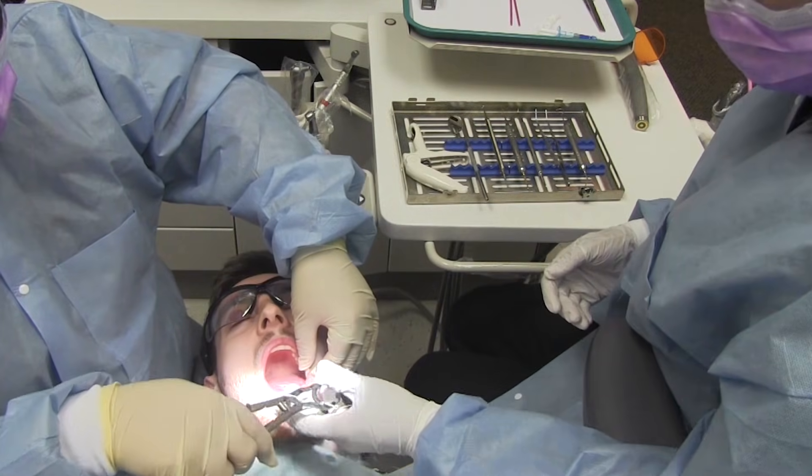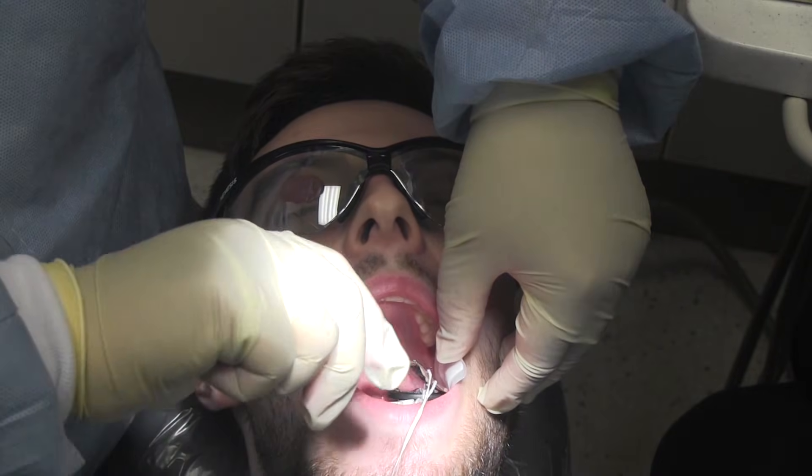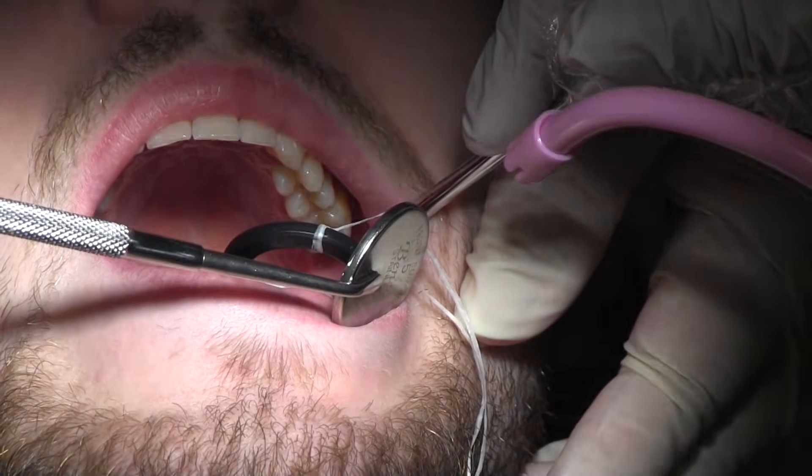If a matrix is required to isolate the tooth for treatment, hand the dentist the requested matrix system. Continue to suction and air-dry as needed throughout the procedure.